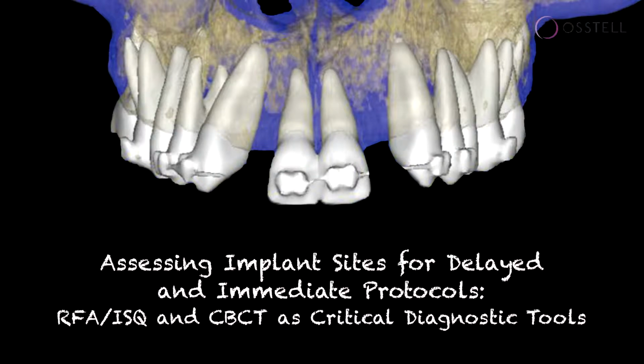have to be able to understand the thickness of the cortical plates, the density of the bone, and all of this is something that we can diagnose preoperatively when we're dealing with three-dimensional imaging technology. So I've kind of dedicated my career in the last more than 30 years. I started with CT in 1985.